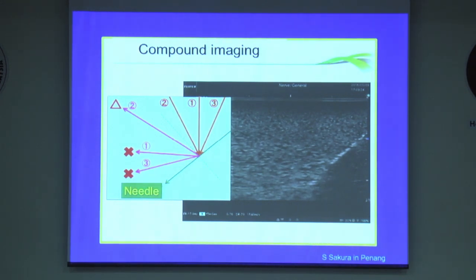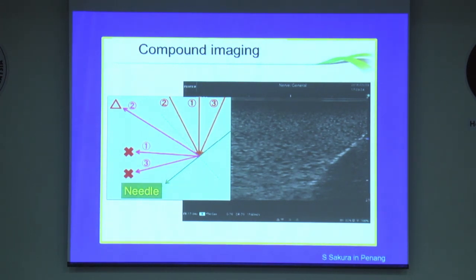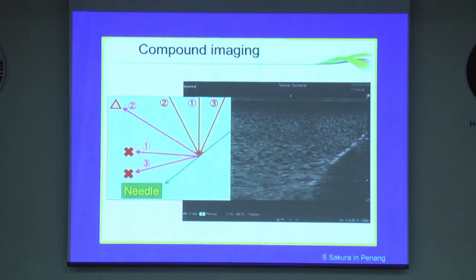With compound imaging mode, the transducer sends signals at multiple angles. Compound imaging combines three or more frames from different angles into a single image, allowing you to see tissue from multiple angles and eliminate artifacts. Unfortunately, you would still have a problem visualizing a needle inserted at more than 40 degrees.